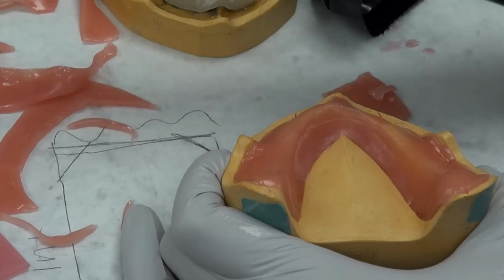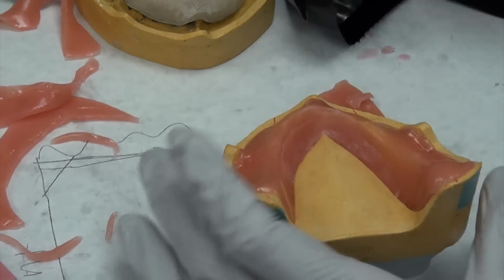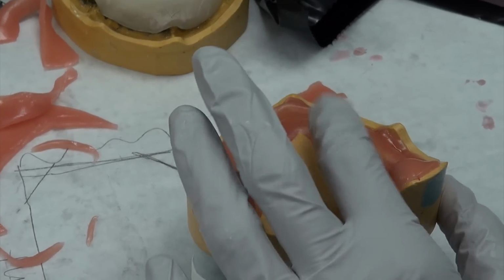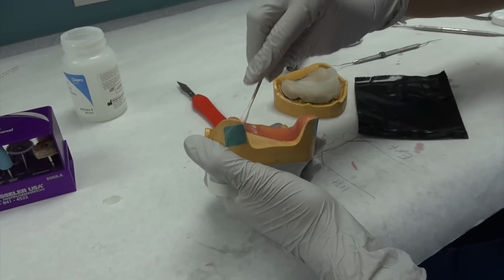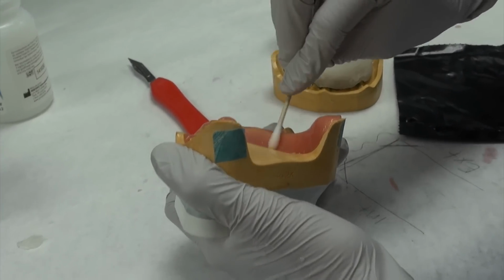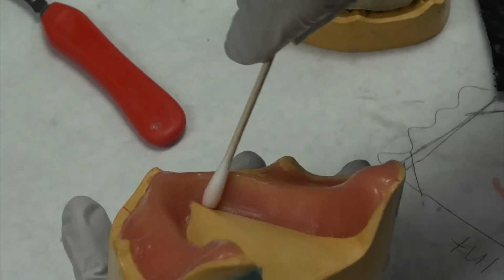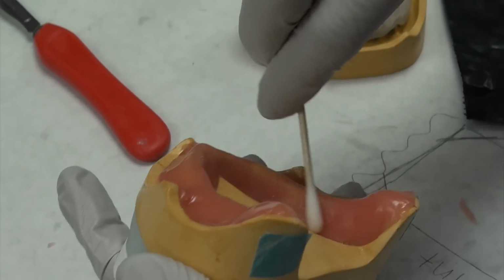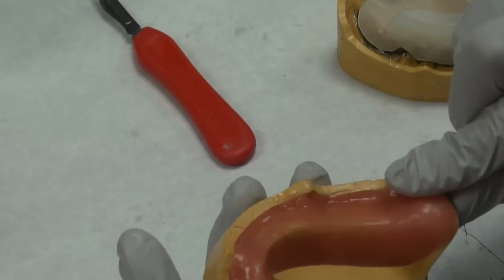Now this will give it strength so it won't fracture. And then again, you'll just go back. Just stop it. Okay, so you see how there's that first coat and second coat? See how easily it blends? Okay, so you're just gonna do exactly what you did previously. Make sure that you're coming all the way to the edges.